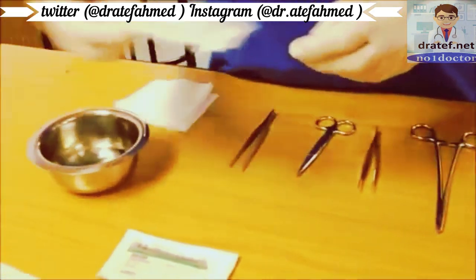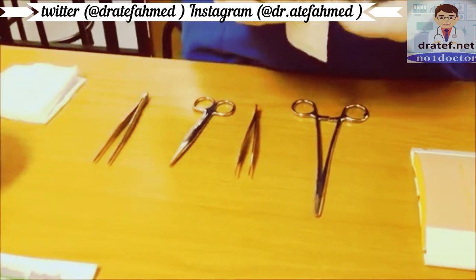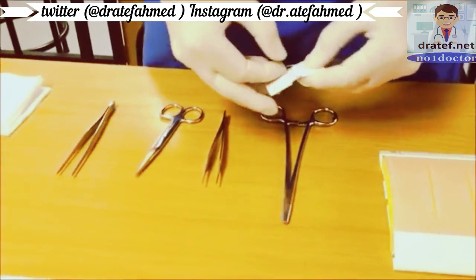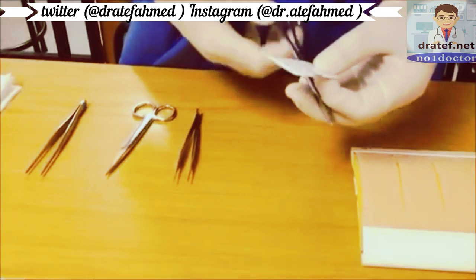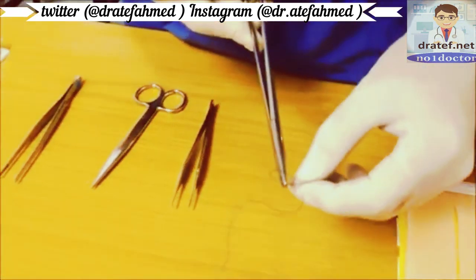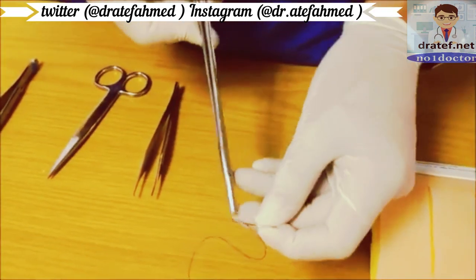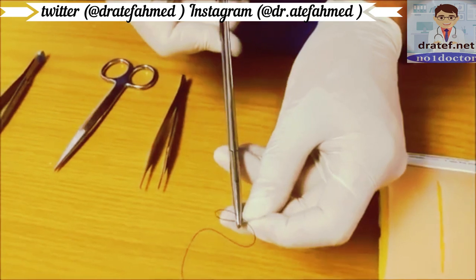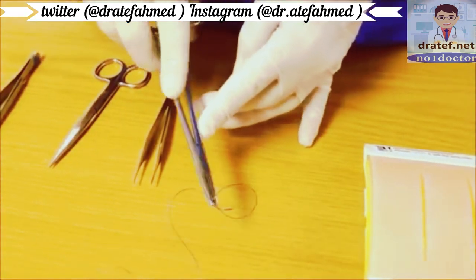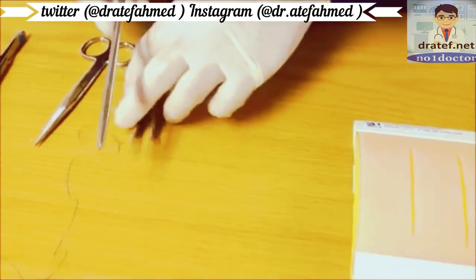In this case we are going to use a nylon monofilament suture. Open your suture, reveal the needle, and grab the needle with your needle holder. Hold the needle about a third to a quarter from the back on the flat surface with the tip of the needle holder — this allows for an easy rotating motion of the wrist to take the needle through the skin.